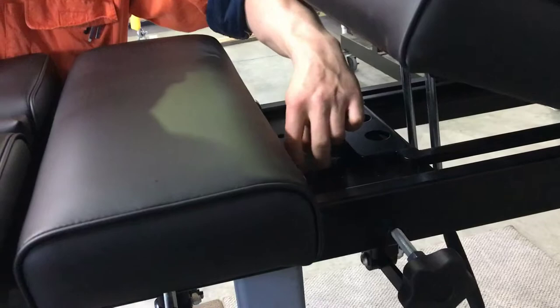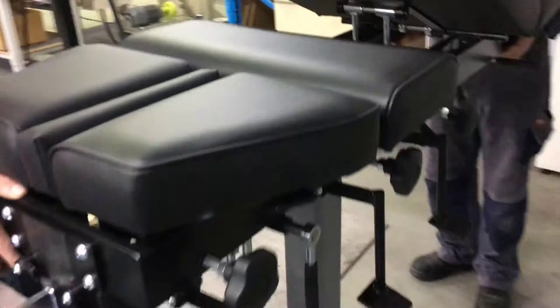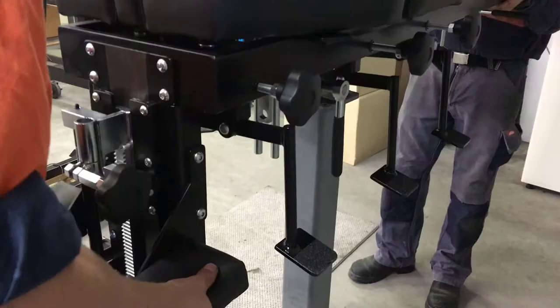Just balance it — the table top comes out quite easily. Then it's a matter of having someone assist you in moving the top portion of the table onto a carpeted area so you don't damage any portion of the table.